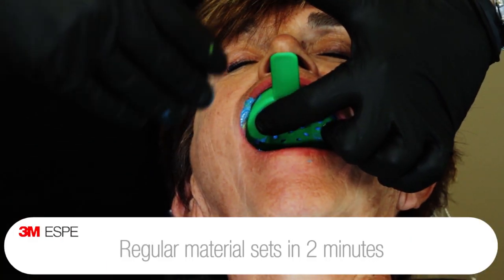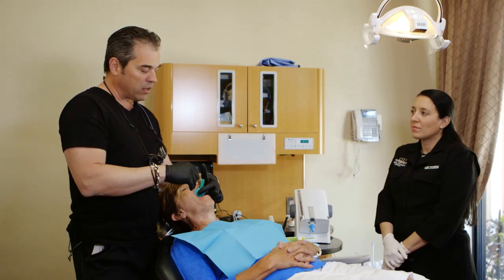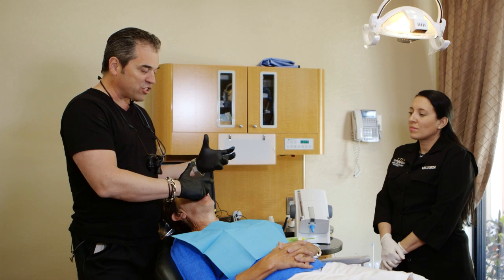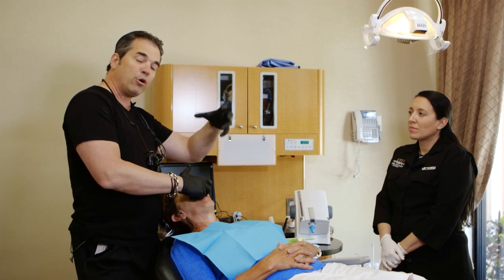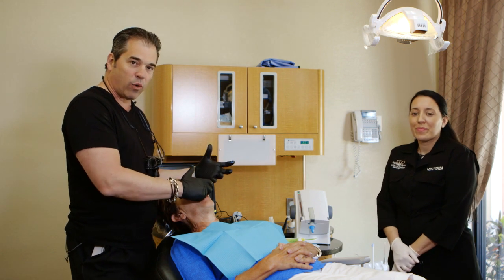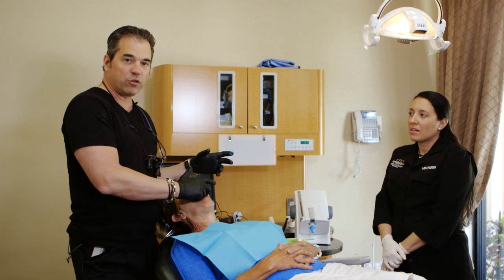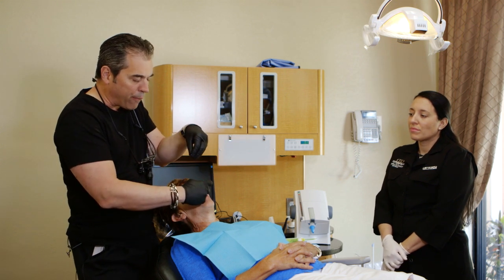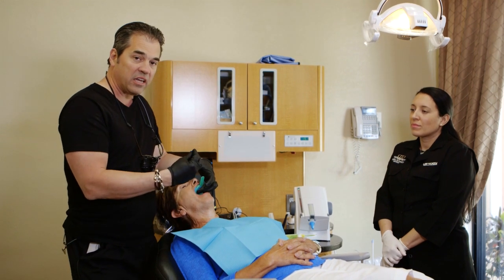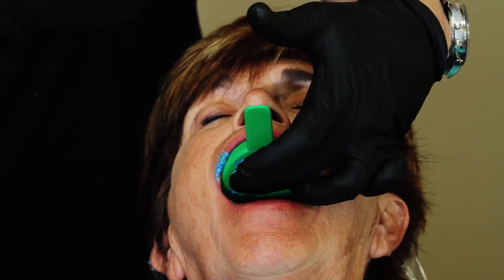One of the things you're gonna notice on this impression is a lot of that light body material will be all over the occlusal tables. A lot of the reaction we get from the laboratories is that they love this product, especially they love pouring up a model when they pull it from this impression, because of the accuracy that's built within the wash material that caught all the little grooves and ridges that were on the occlusal table. Sometimes we just go around the prep and the heavy body doesn't capture the detail that we need within the occlusal table. So I'm a big advocate for using as much wash material as we can.